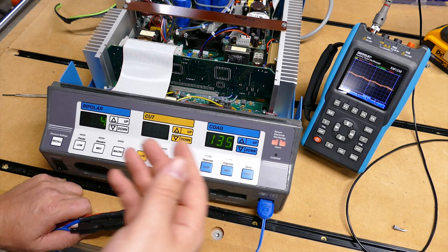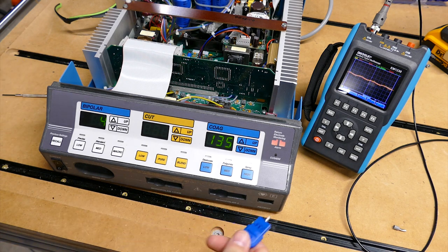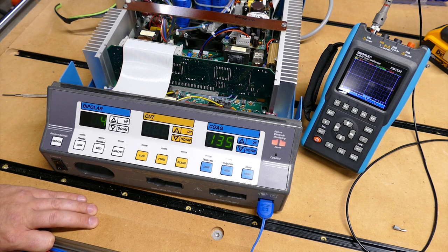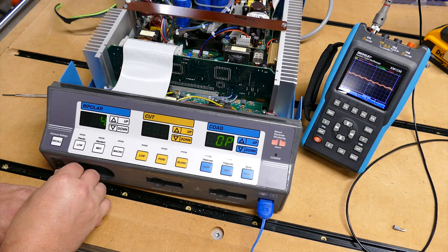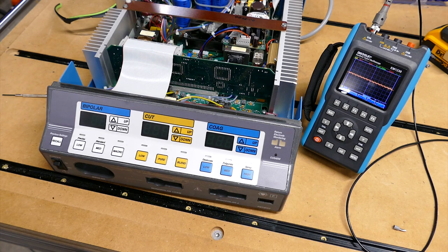I'm going to plug it in, let it stabilize for about 10 seconds. Then I press the up key. Now it's asking for 135 ohms. Now let's see, here we go. 135 ohm key. Again, we let it set. And there we go. Press up and it saves your values. And here we are back at the home screen. We're on calibration 4, which is your REM. In order to exit the calibration screen, shut the power off. Disconnect your 135 ohm key. Let's power the unit back on. Let's take a look.